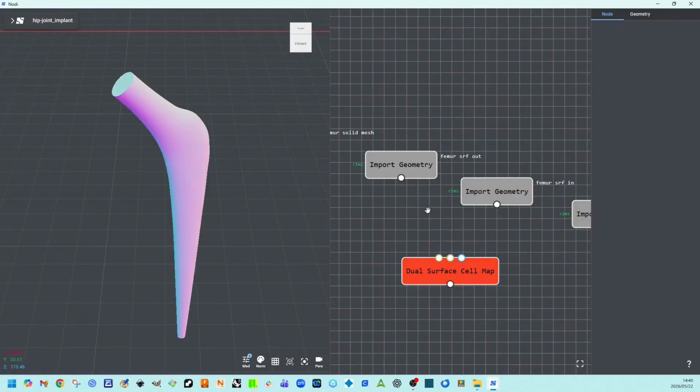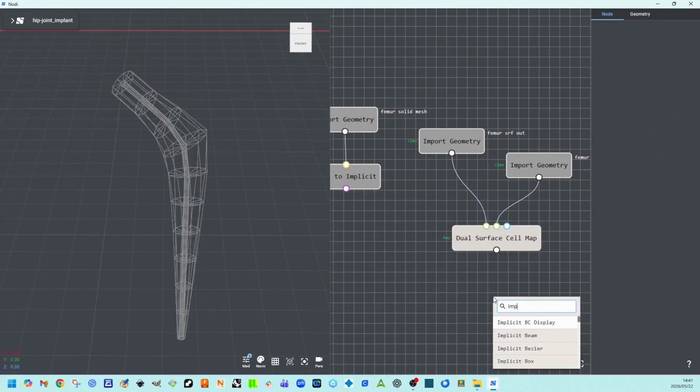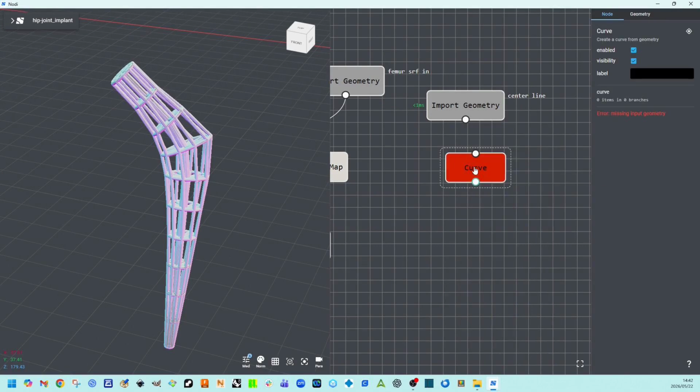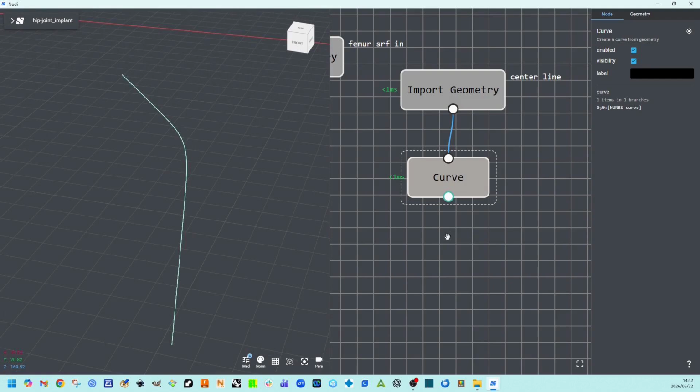To wrap the bone in a lattice, we feed the surface into a dual surface cell map and an implicit beam, with the cell type set to cubic. Every edge becomes a strut.